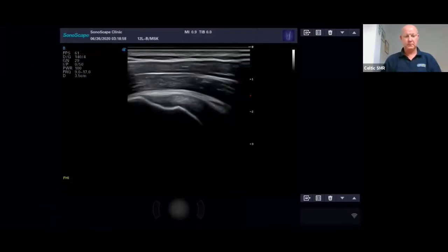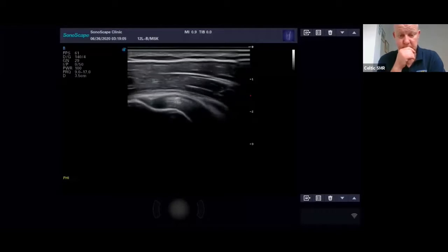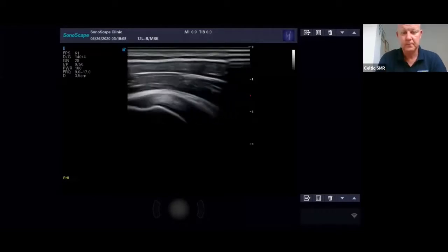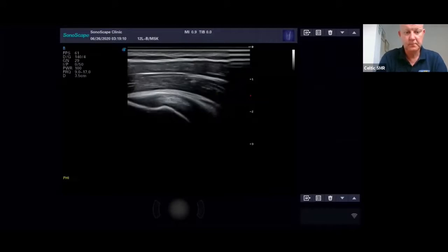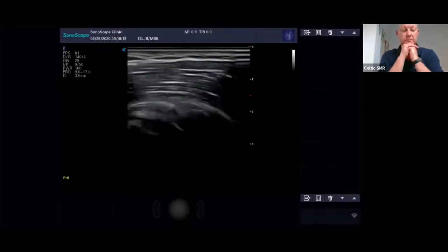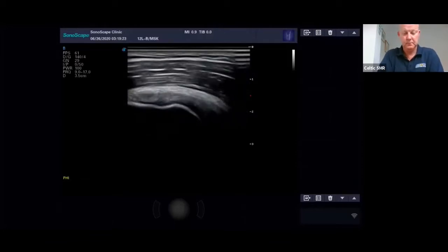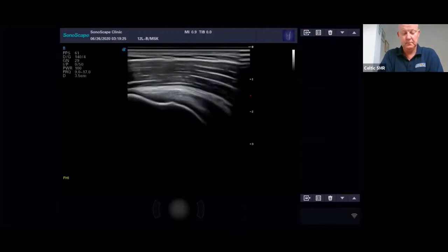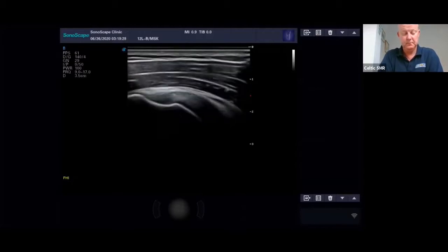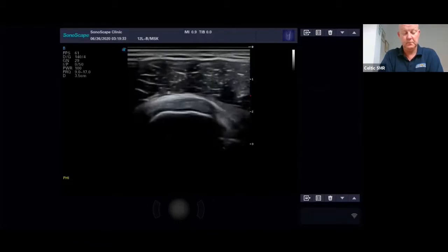Now, don't forget that these tendons are quite broad. The beam that's coming out of this probe is only 1 millimeter thick. So you're effectively seeing on the screen a 1 millimeter slice of this tendon. So in order to visualize the whole tendon, you need to scan all the way through. There's the biceps tendon again, all the way through, and I'm through into infra now as well. So just don't forget to scan all the way through the tendon, and that's also in transverse.